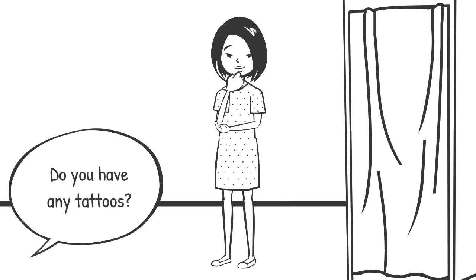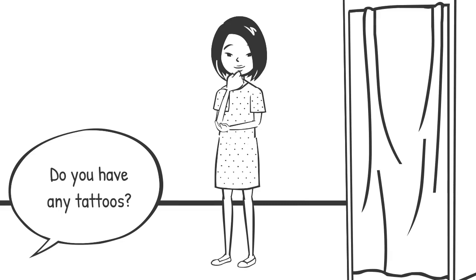Most people with tattoos will be completely fine during an MRI scan, but some tattoos contain small amounts of metal. This can cause heating of the tattoo during the MRI scan, so be sure to let the radiographer know if during your exam you begin to feel any discomfort or warming, and the scan will be stopped.